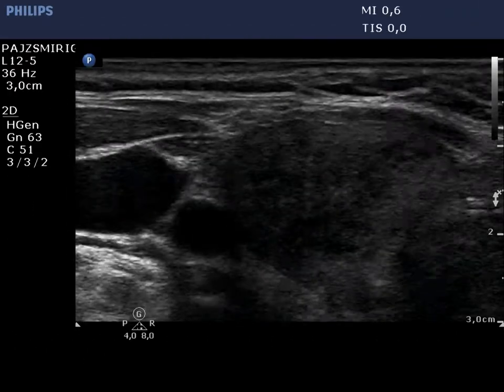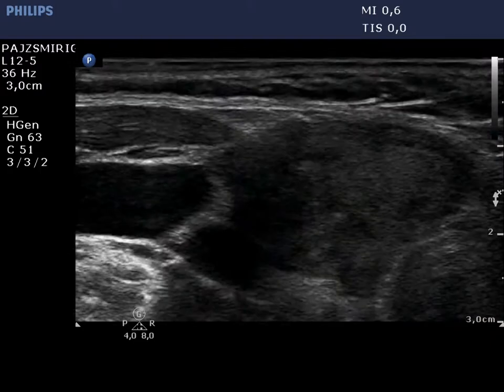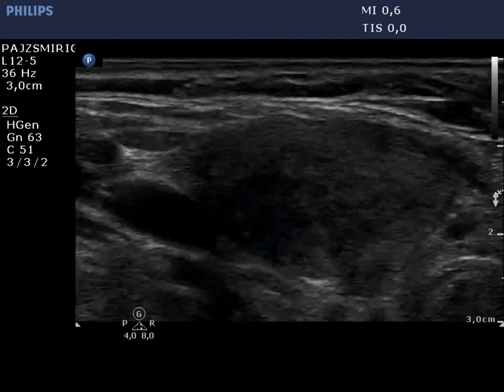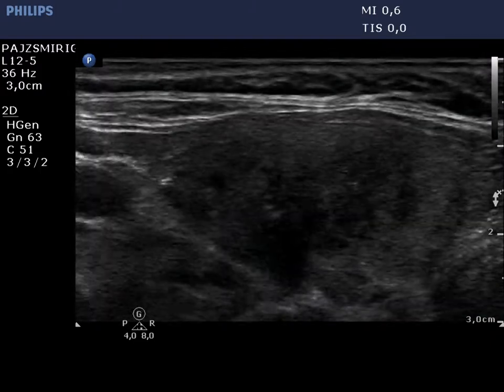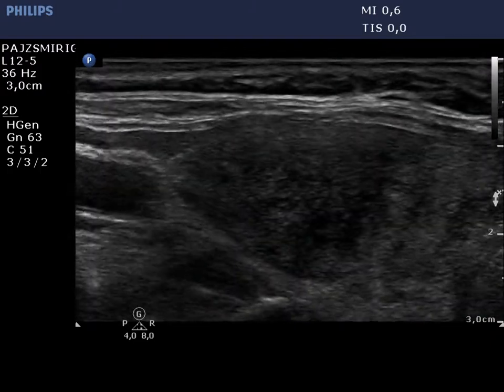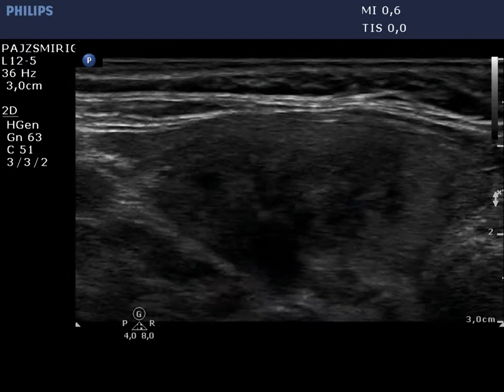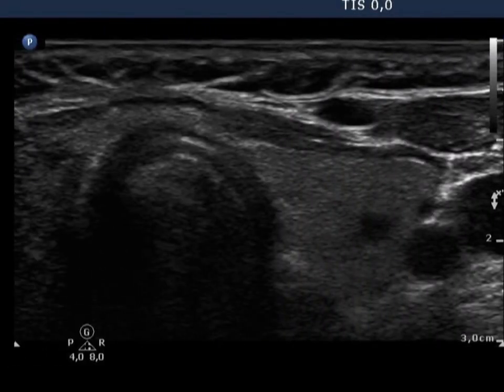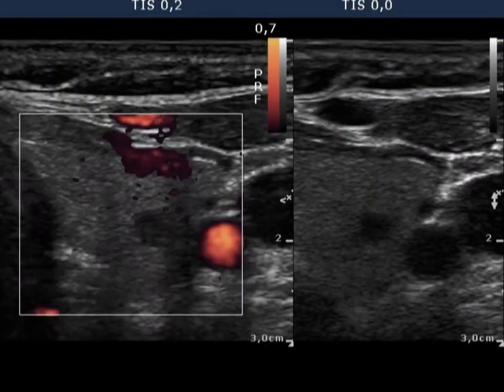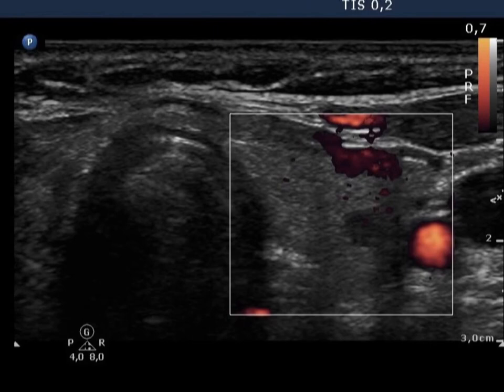In the video, first the horizontal then the longitudinal view of the right thyroid can be observed with the typical presentation of De Quervain's thyroiditis. The left lobe is intact with a small insignificant lesion.